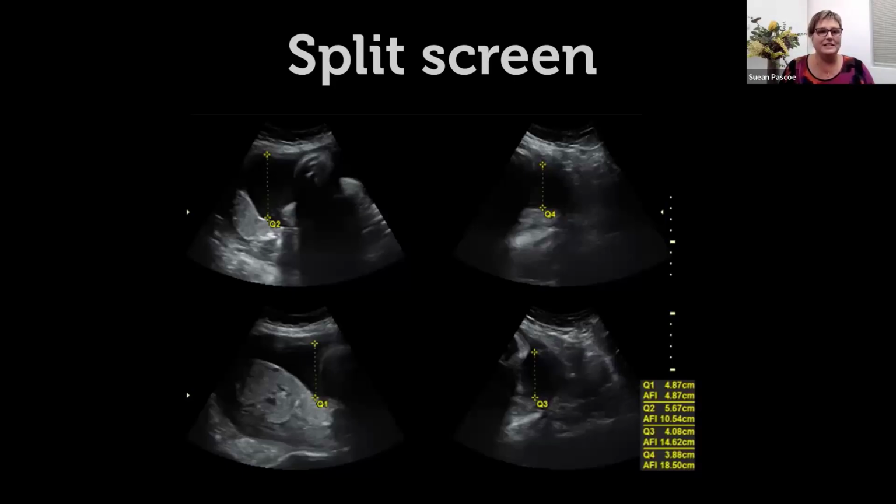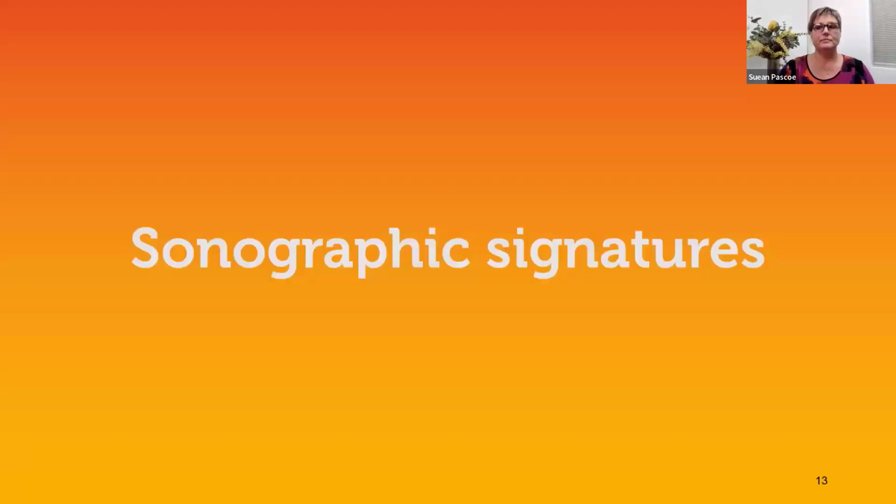because there's no doubt once the patient's there, there's a bit of extra pressure on it, and I found myself many times on a machine kind of muttering under my breath and getting very frustrated because I couldn't get this to work properly. But it's just getting into the groove of what the order of the button pushing here is, and then it demonstrates that whole amniotic fluid index on a single picture. And for each measurement that you make, you need to make sure that those measurements then record to the reports page on the machine so that it comes up at the end when you print your reports page out.